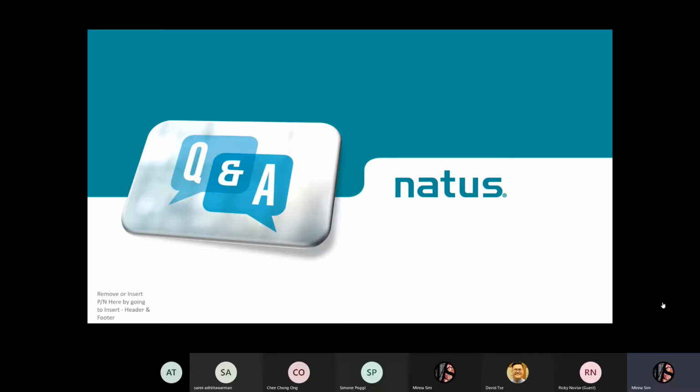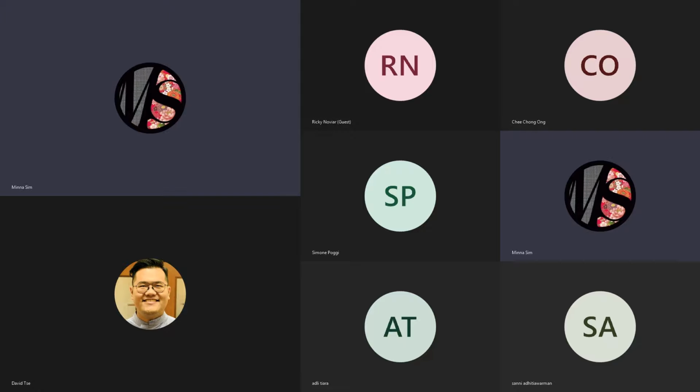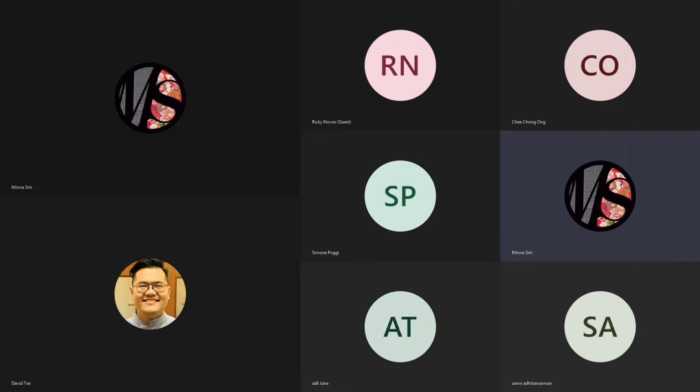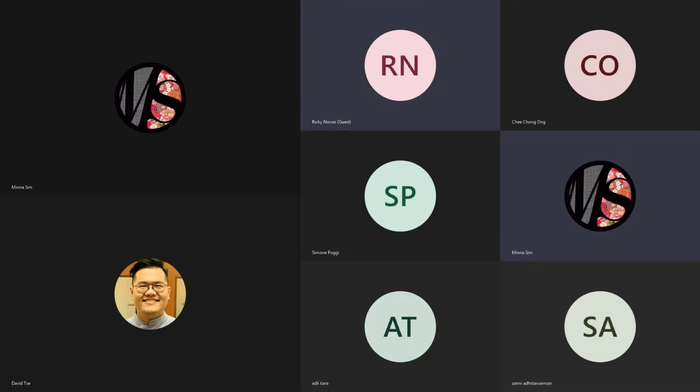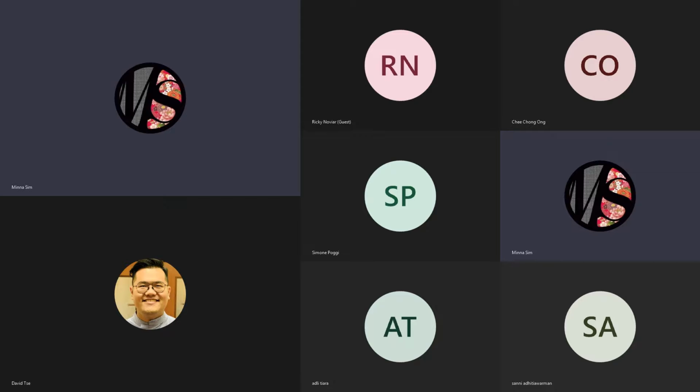software demonstration to discuss more on the software itself. Let me change my screen.